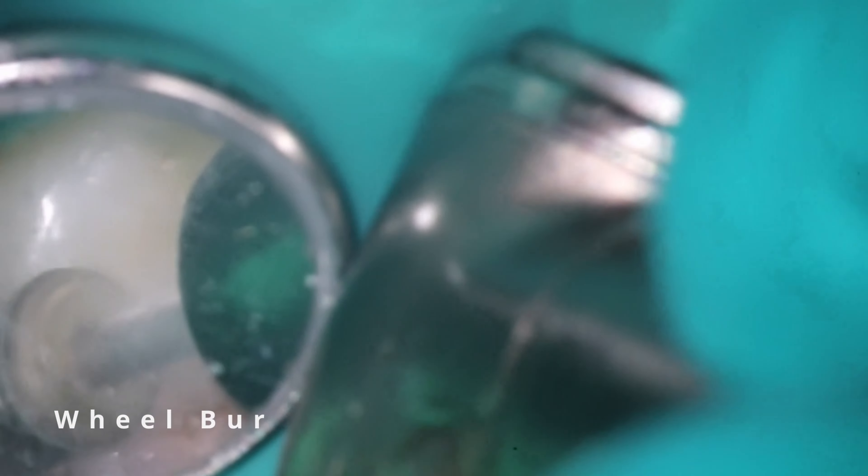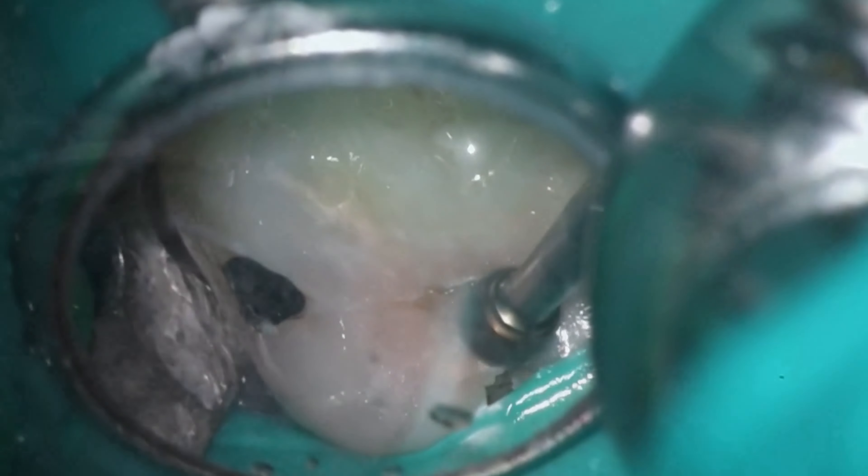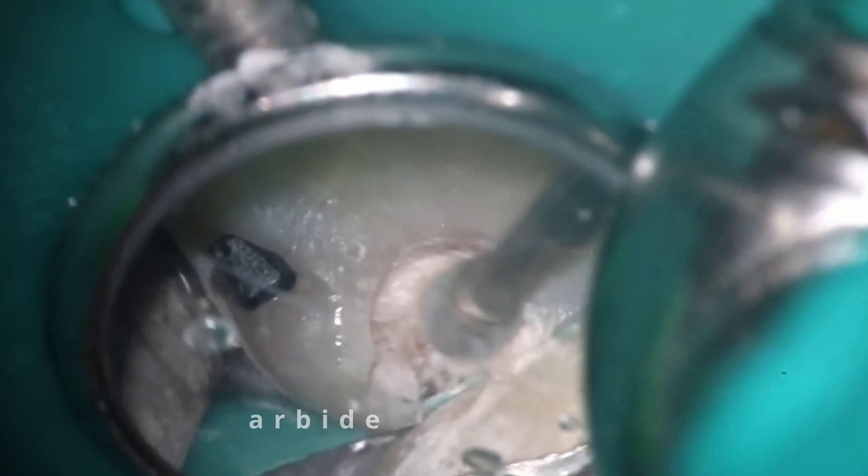First thing we do with every case is take it out of the bite. As you've seen me do before, I'm going to remove those cusps. He's already fractured it a little bit — certainly don't want this to fracture anymore. Working with a new assistant, so we're trying to get this technique a little bit better.